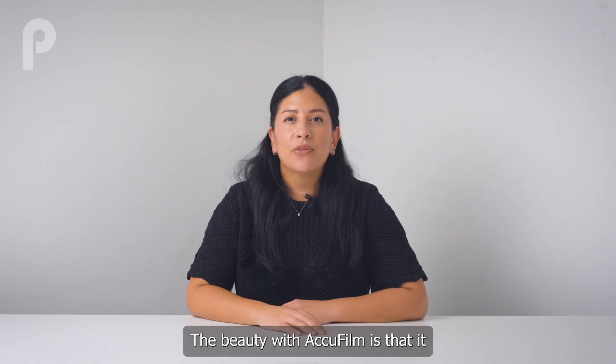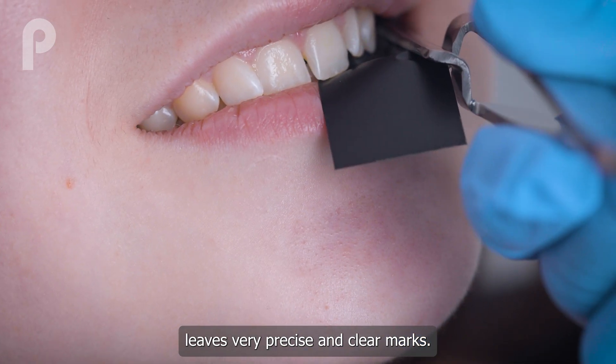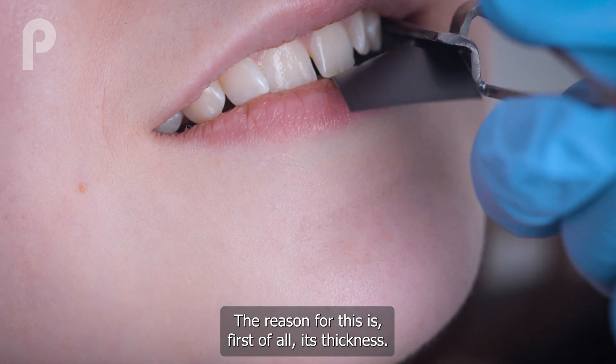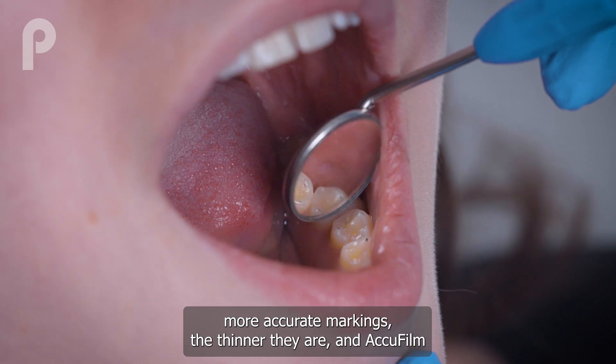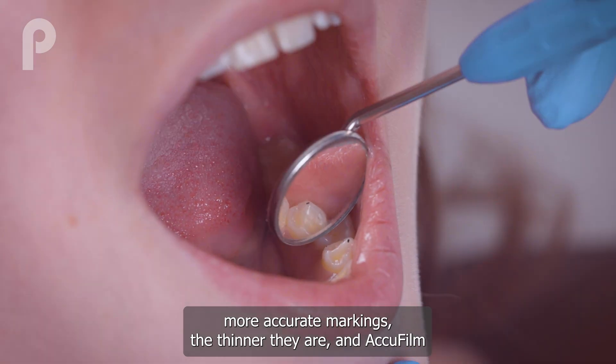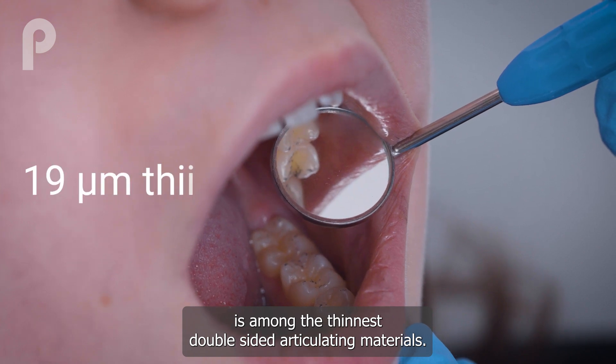The beauty with AccuFilm is that it leaves very precise and clear marks. The reason for this is, first of all, its thickness. Articulating materials always give more accurate markings the thinner they are, and AccuFilm is among the thinnest double-sided articulating materials.